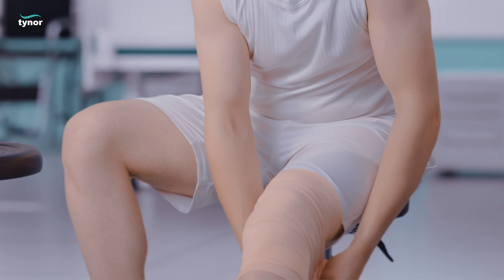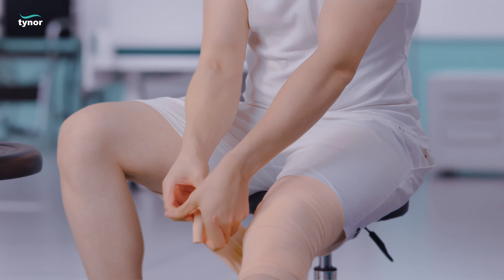Continue wrapping the bandage until the entire affected knee is covered. Now secure the bandage with the given elastic pins.